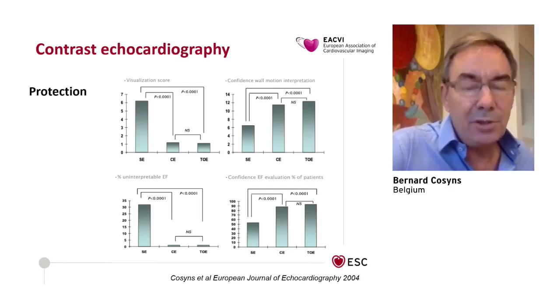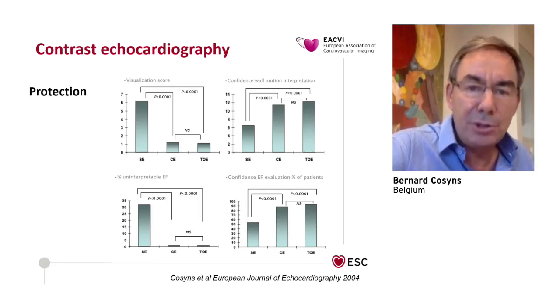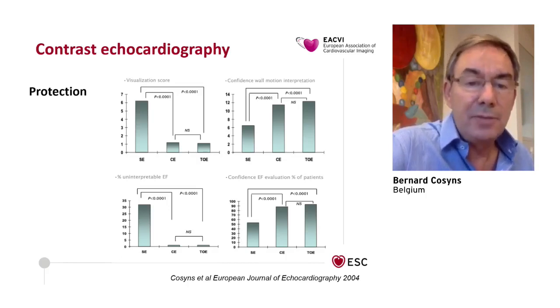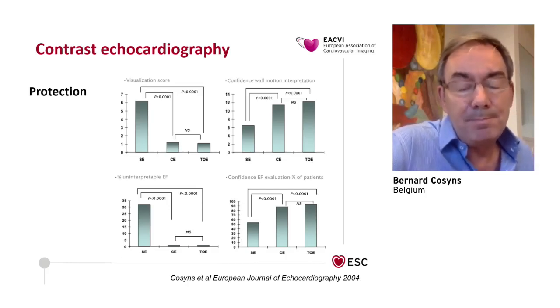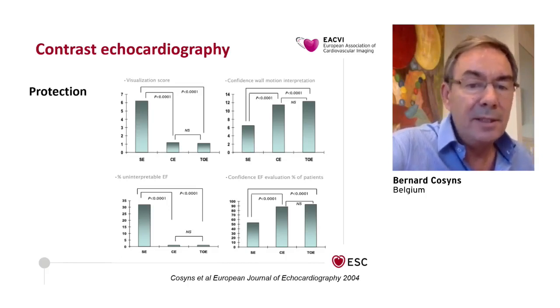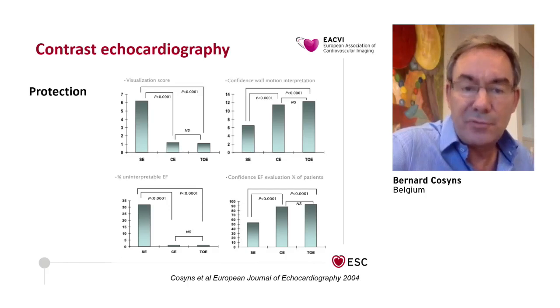And just regarding protection, of course, we cannot say that contrast echo does not require more protection measures, because in fact, you need to have someone to help you inject the contrast agent, that's for one, meaning that you expose more people to the disease. And in this particular patient, he was critically ill, so already having an intravenous line, not prolonging too much the time of the procedure, which should be shortened as much as possible.